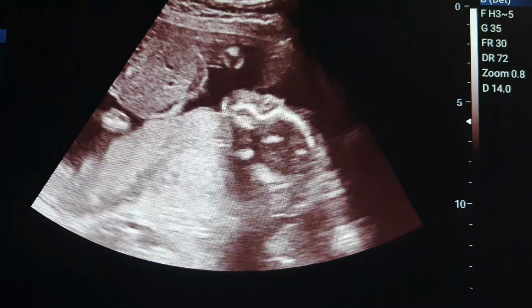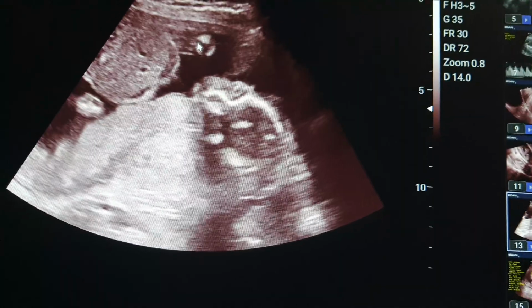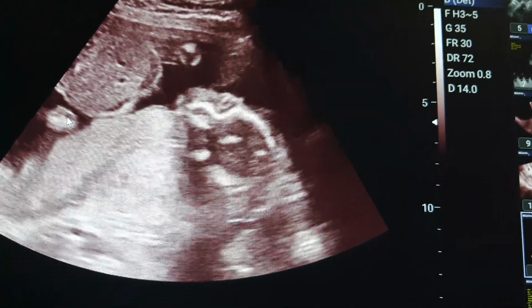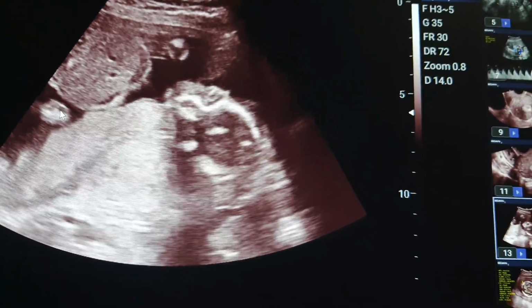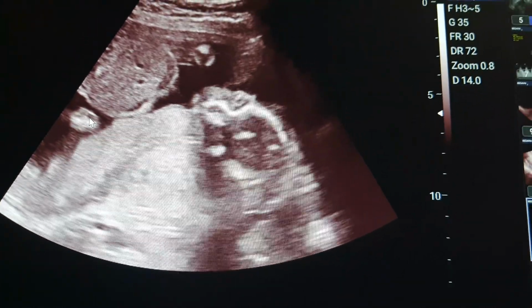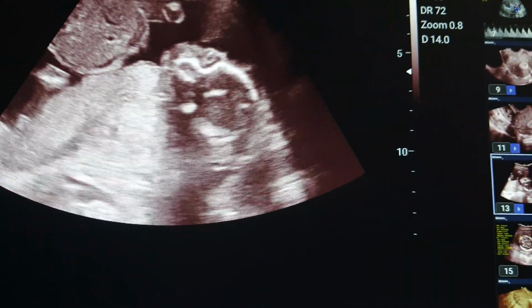What can be seen here? A part of the fetal abdomen. This is a part of a transverse section of the fetal abdomen. And here are parts of fetal limbs. So if you want to understand this picture, you should be sure what you can see at any time. At any time when I'm pausing the picture, I can ask you about any of the contents of this picture. You should know what these contents are. Okay, let's resume the scene.